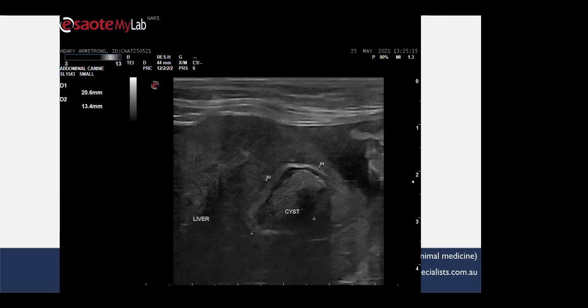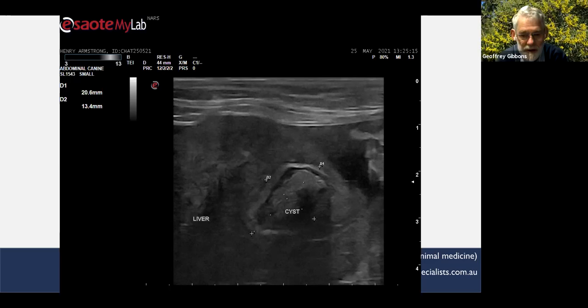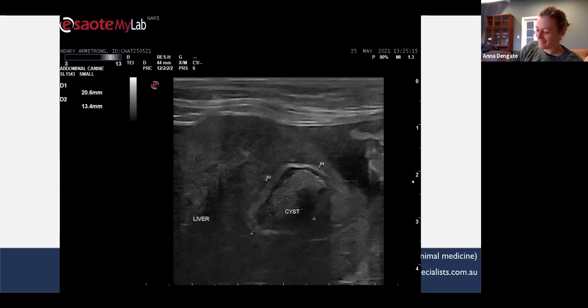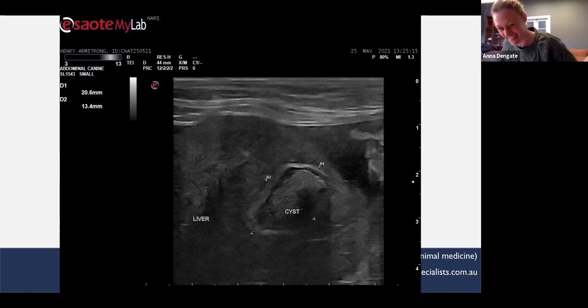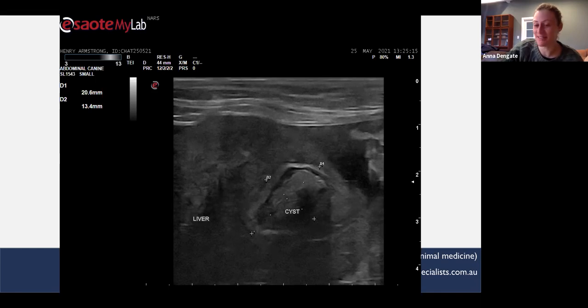I was just thinking of hydatids. I've never seen a hydatid cyst, but I guess that's a differential for a cyst more than mass. You won't see a hydatid cyst in a dog. Dogs have the tapeworm, not the cyst. They're a primary host. Good point. Caught me out. That shows how often I've dealt with hydatids, full stop. Exactly. That used to be a trick question for the students. I'm going to stop putting that on my differential list when I do ultrasounds.